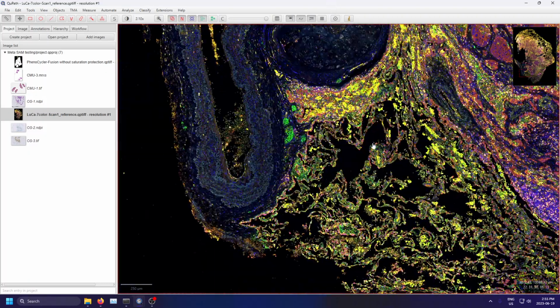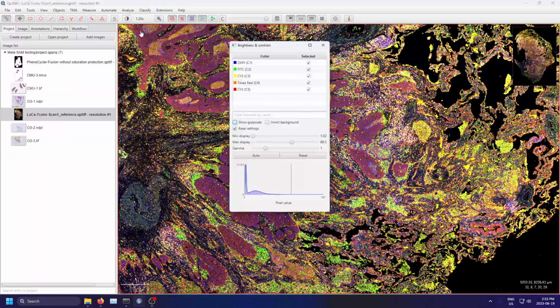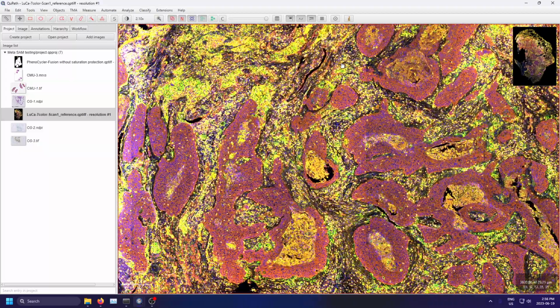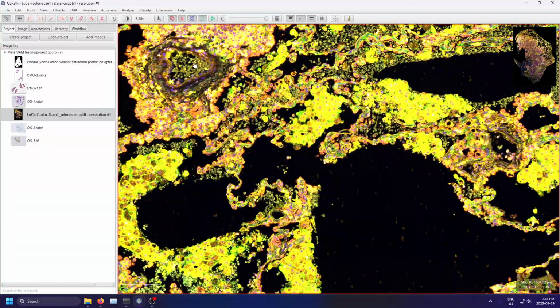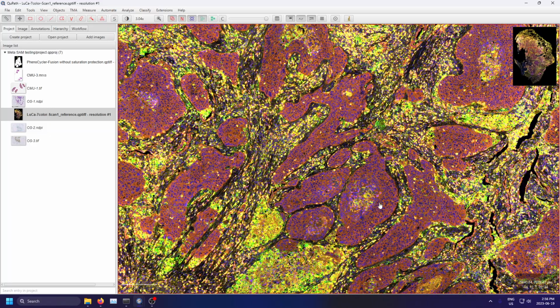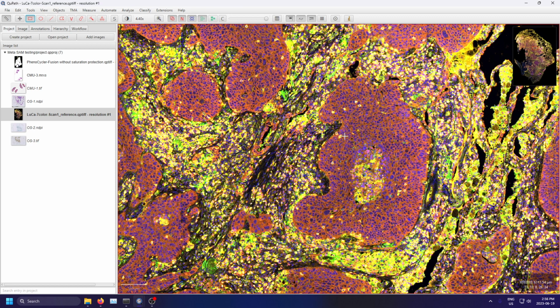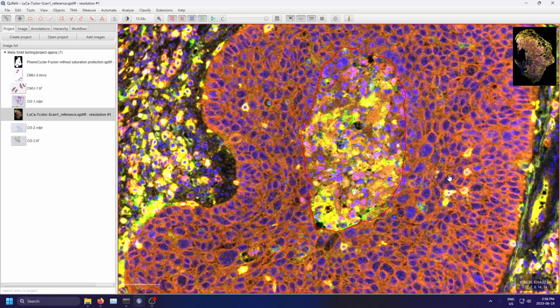What if we have any arteries in these sections? Without knowing the histological markers present, it's hard to say whether or not something is an artery or a different structure entirely. See if we can identify this little mass in the center, which doesn't seem to have a very clearly defined edge. Yeah, no, this is doing a reasonable job.